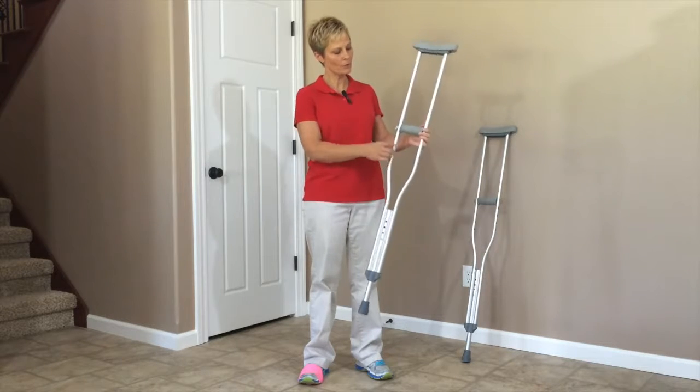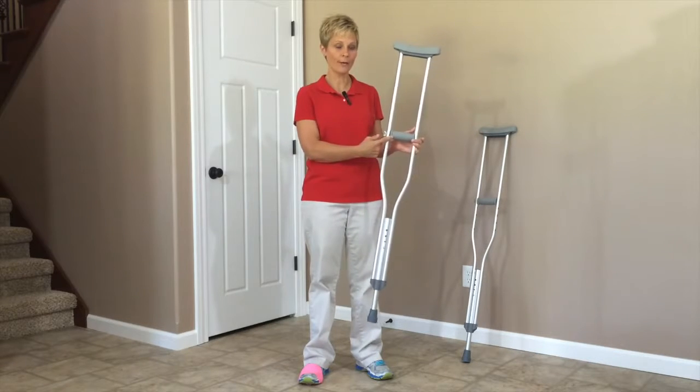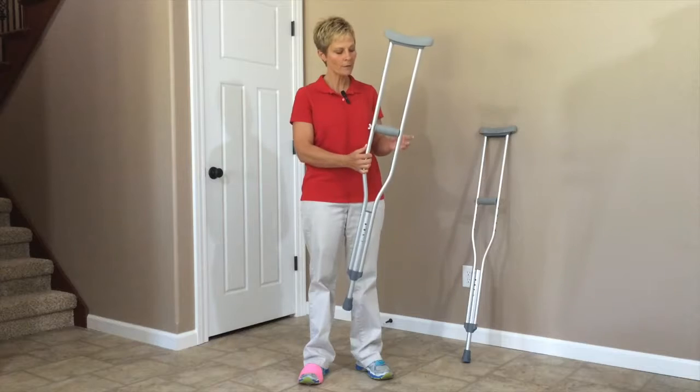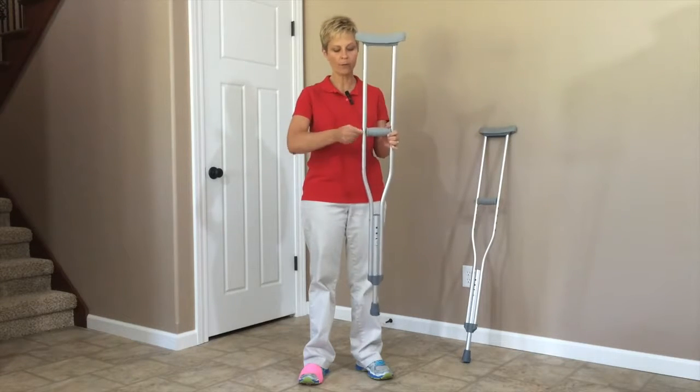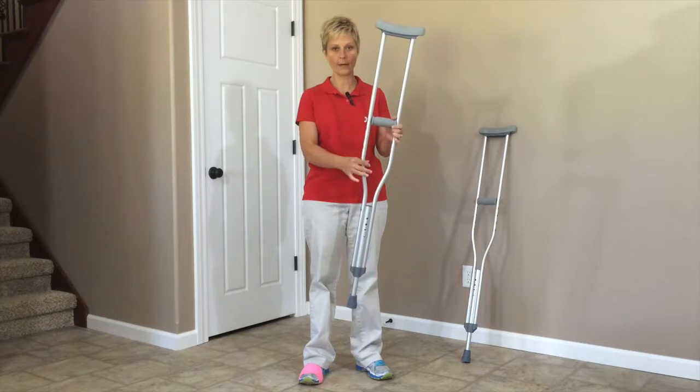At the top of the crutch you have an adjustment in handle height or grip height for your hands. This is usually a bolt with a wingnut, and you can take that off. That wingnut comes off and then you adjust the height of the handle.